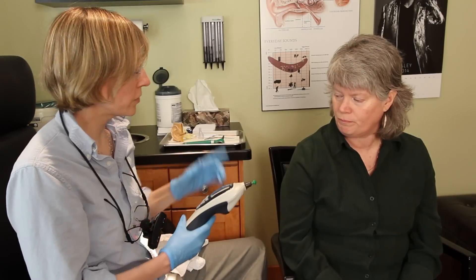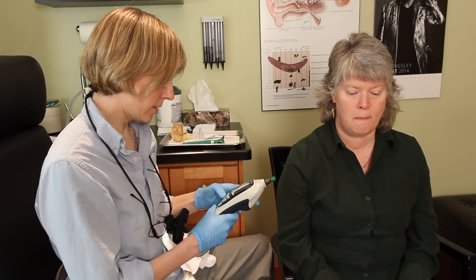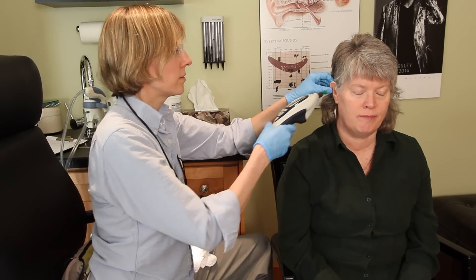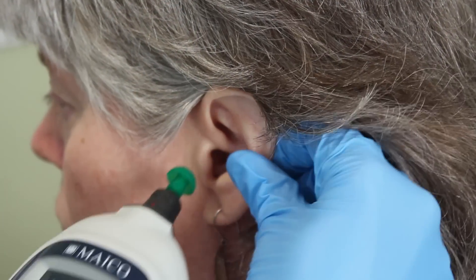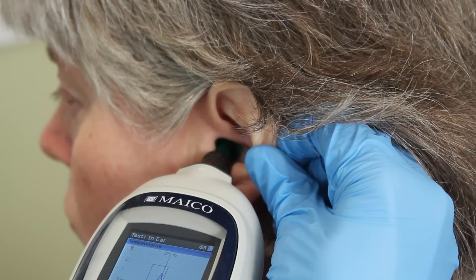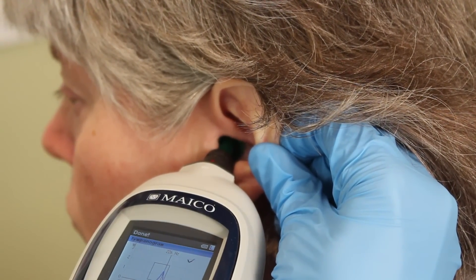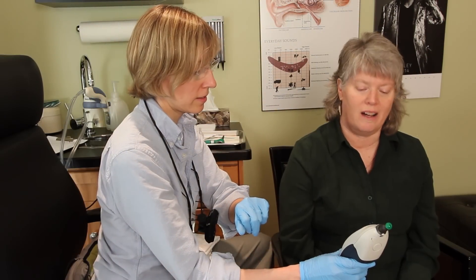We're going to just see if your eardrum is intact before we begin the procedure. You're just going to feel a little bit of pressure in the ear and then you'll hear some droning. Your eardrum is intact. That's what we want to see — that pressure peak within that wax. Your volume is good and that volume will probably increase once we remove that wax.